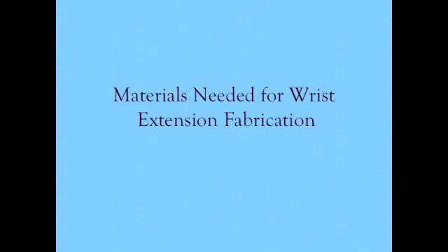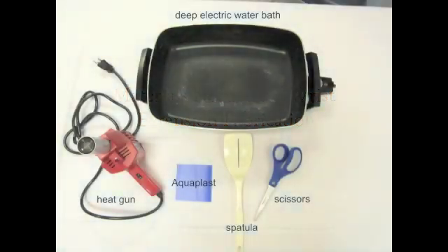These are the materials you will need to fabricate the wrist extension splint. You will need a deep electric water bath, a heat gun, a piece of aquaplast, a spatula, and a pair of scissors.